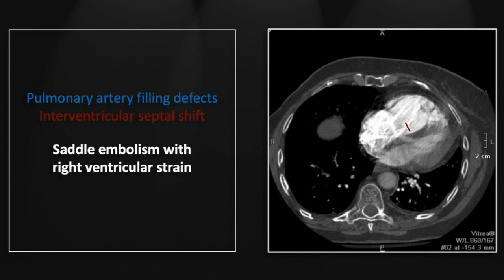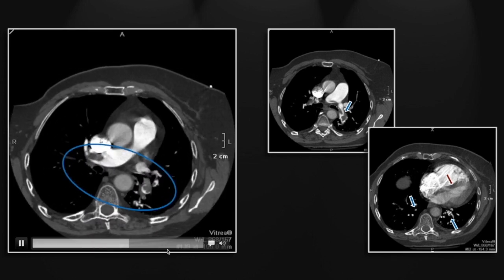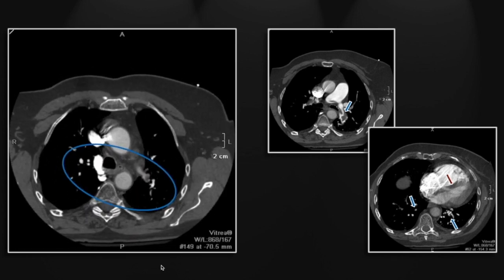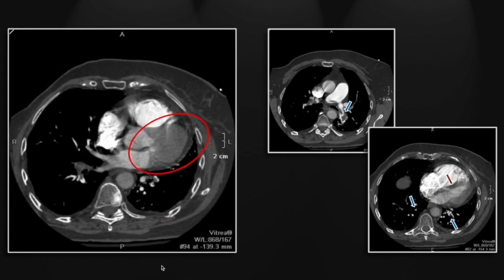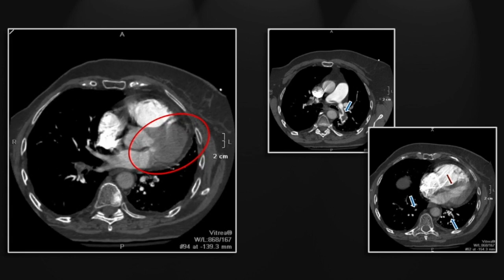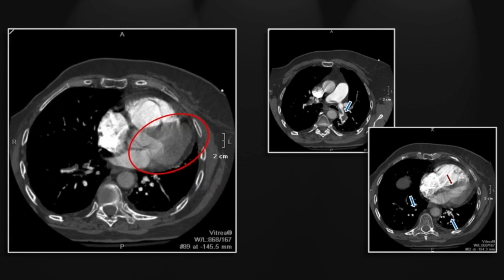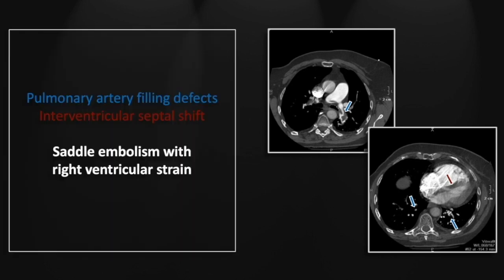These are the exact findings of right ventricular strain that emergency physicians across the country are now asking to have included in reports. There are the filling defects, and here the straightening of the septum, and relative enlargement of the right ventricle and decrease in size of the left ventricle. So that's a case of saddle embolism with ventricular strain.